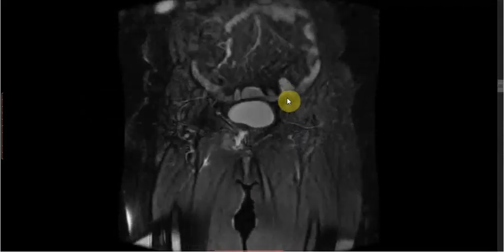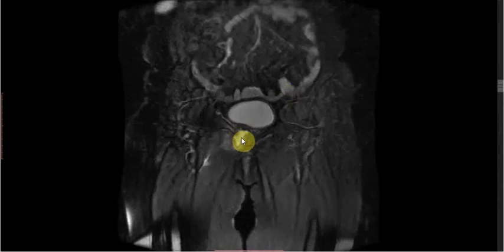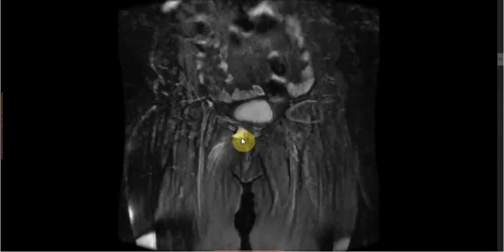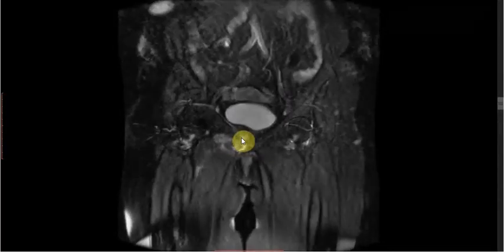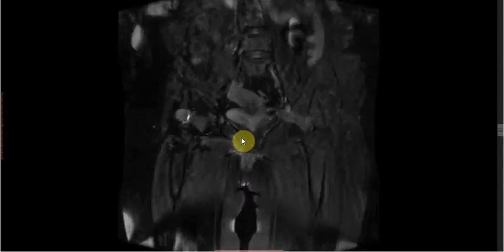There is also presence of a displaced fracture involving the right superior and inferior pubic ramus.